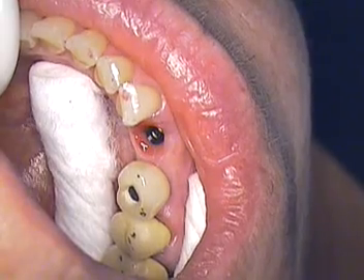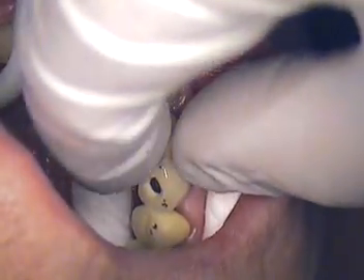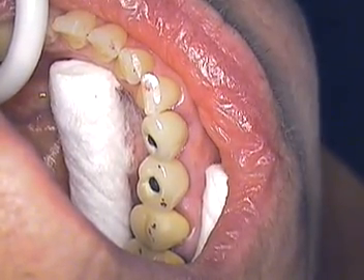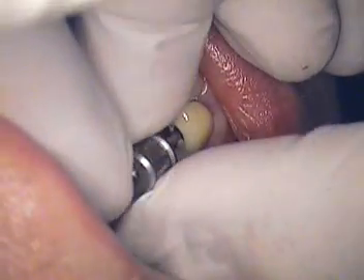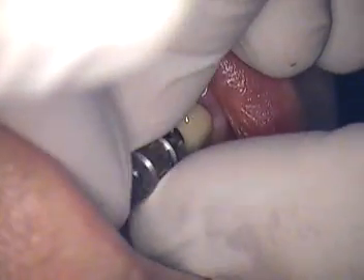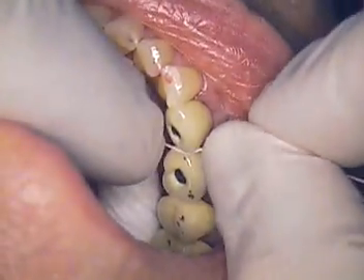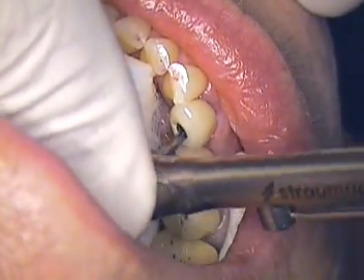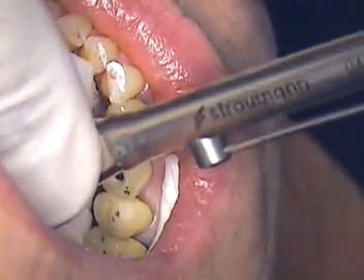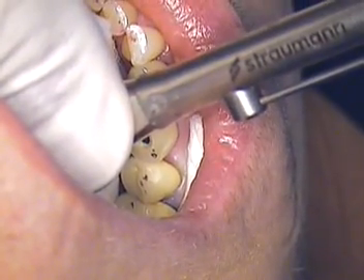Now we're going to go ahead and place the abutment next to it — number 28. We'll slide that in and hand tighten that one. We've already reviewed the color, shape, and size of the teeth. Everything good, Julia? Feels comfortable? No tightness? Good contact there. We're going to torque it down to 35 newton centimeters again. Right now we'll tighten it to 35 newton centimeters.